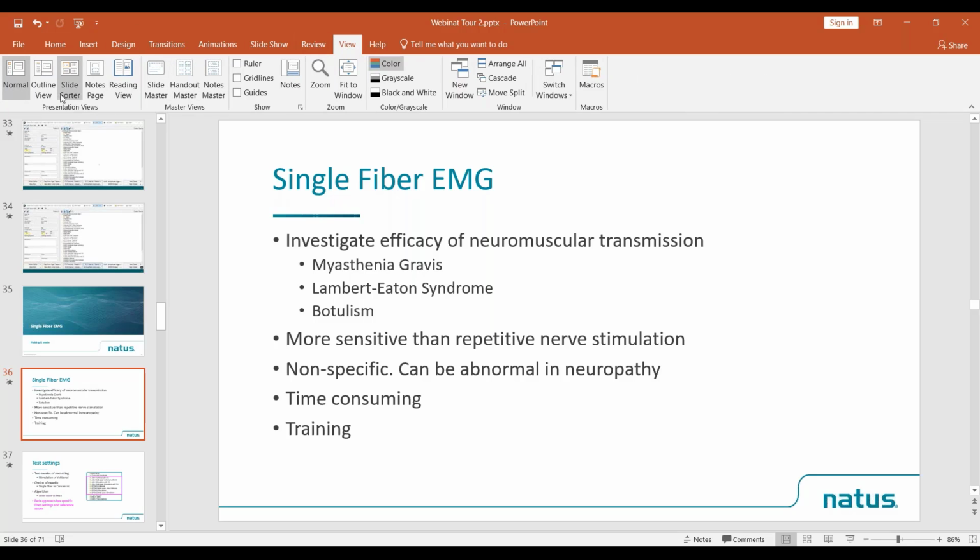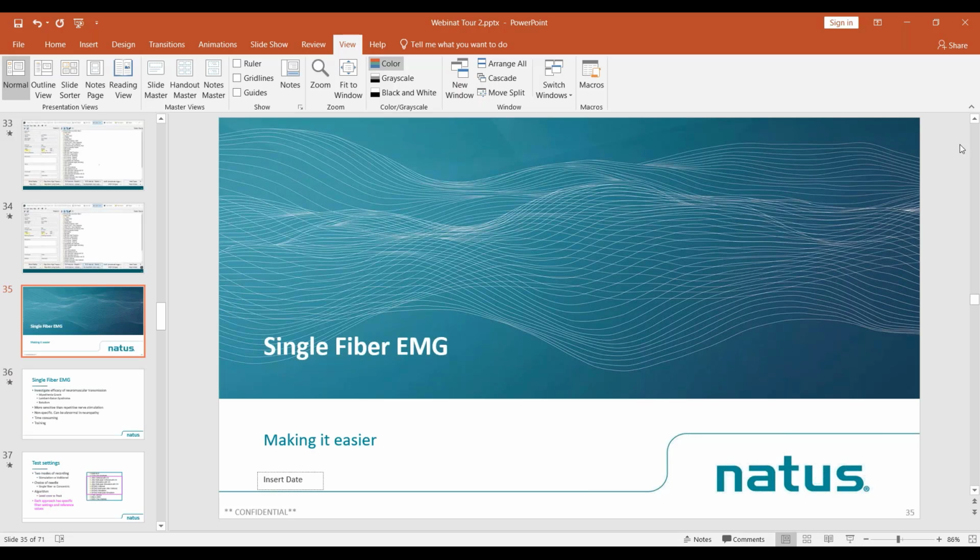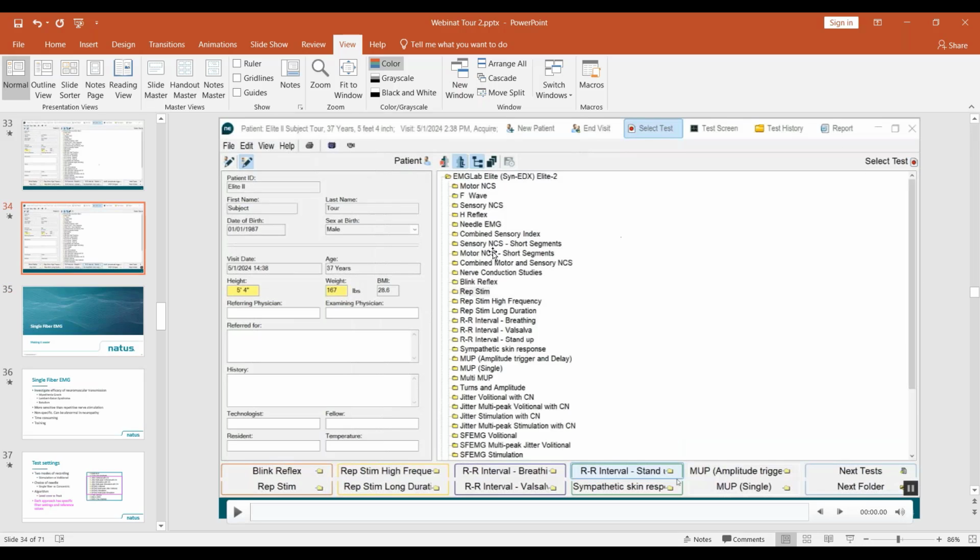Let me start the slideshow. Seem to have lost my icon over here. That's okay. We can continue in this screen over here.